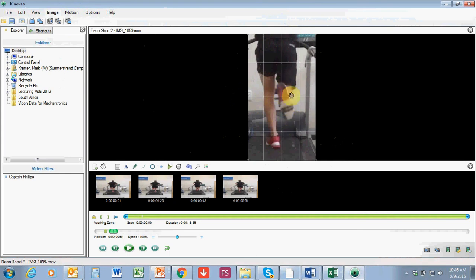So this is what's called medial heel whip. You can see that the heel tends to whip medially towards the midline, meaning that the toes are more lateral. This is completely normal. It tends to happen if I just look at this other foot. As the foot tends to strike, there's a certain amount of pronation that happens. When I have foot pronation, there's a certain amount of tibial internal rotation that tends to happen. And the only time that that can be released is as the person toes off and recovers. It tends to counterbalance. So the heel will tend to whip medially, and a normal amount is about 5 degrees.